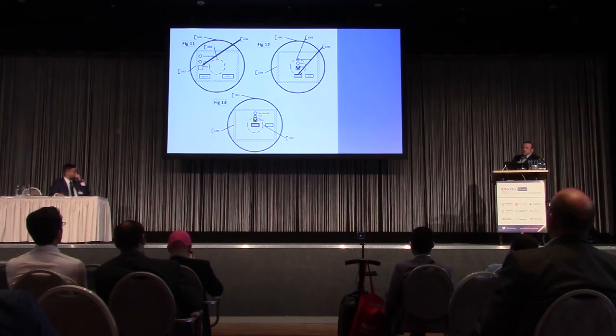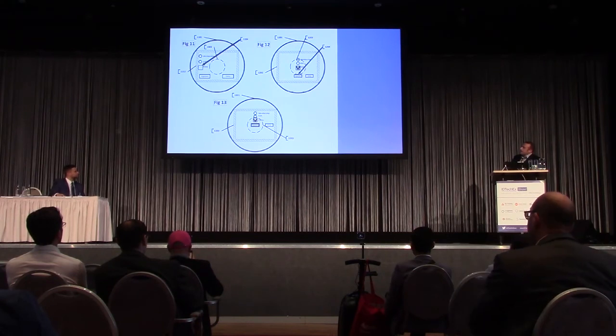Perhaps because the user keeps focus for 1.5 seconds or some time frame that is indicative of his choice. And the system selects it, so there is a check, simply by selecting this particular UI component.